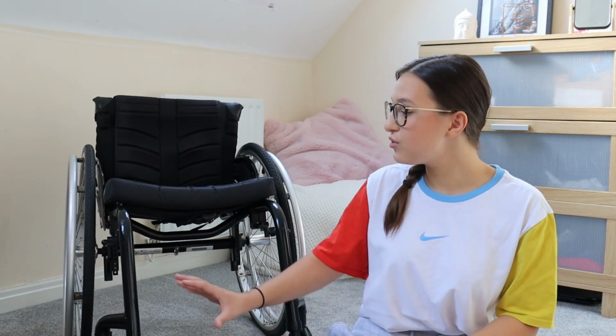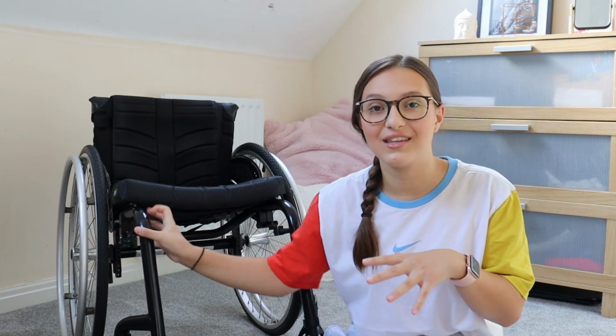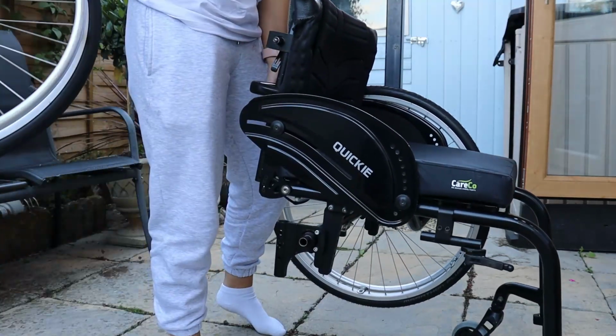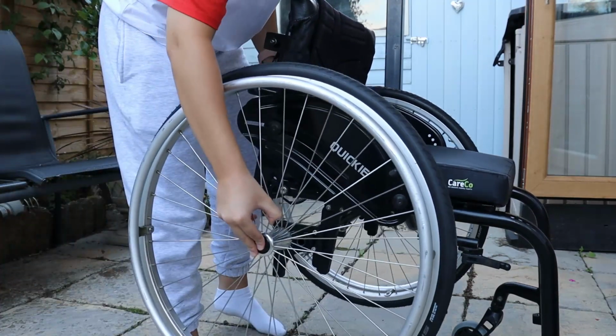Something else that I took into consideration when buying this wheelchair was the frame. Originally I was looking at folding wheelchairs which would fold up much like my old one, but I ended up going with a rigid wheelchair, so all the frame is attached and it doesn't fold up, but you're still able to fit it in the car because you just press the black button in the middle and you pop the wheel off and you can put it back on so easily.